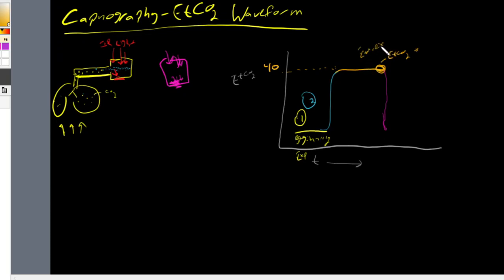Eventually all that gas, all that CO2, will end up in this chamber. And then 4 is inspiration. And that is the end-tidal carbon dioxide waveform.